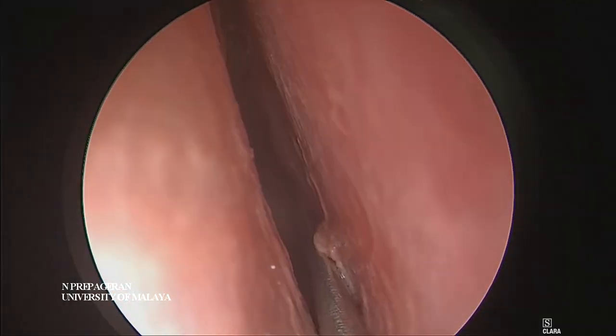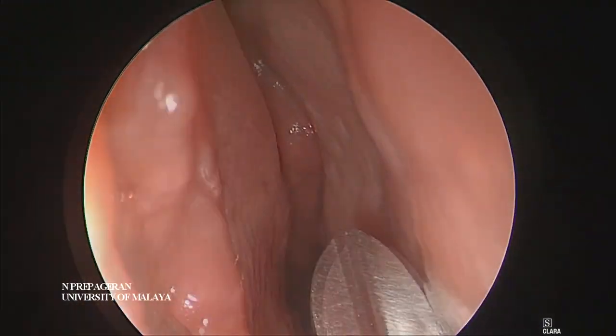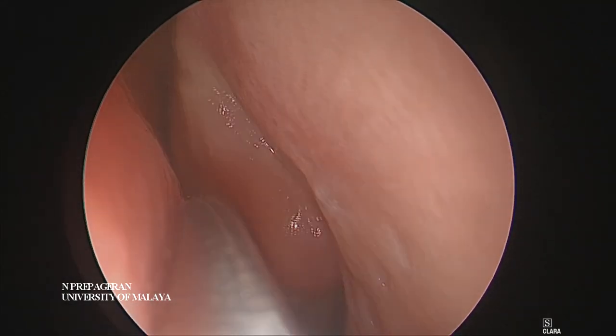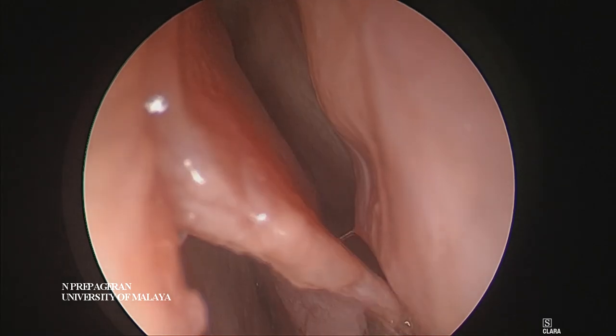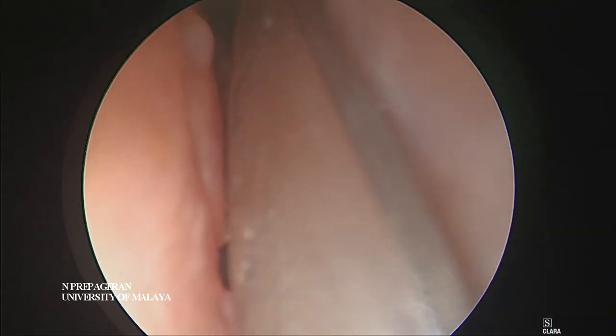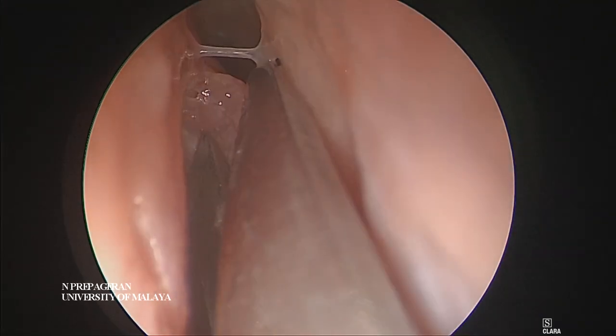The upper margin - we usually cut maximum along the mid portion of the middle turbinate because you want to preserve smell if you can. Smell is important for you to appreciate food.